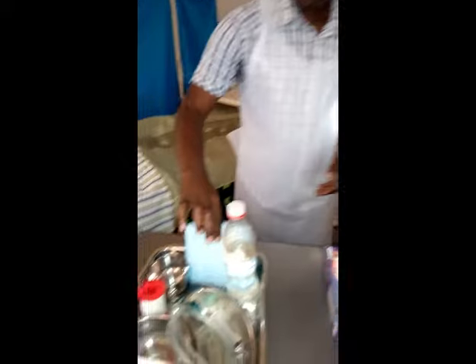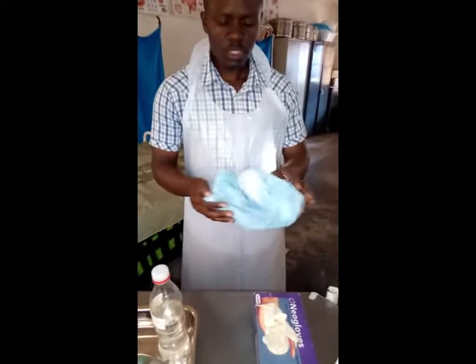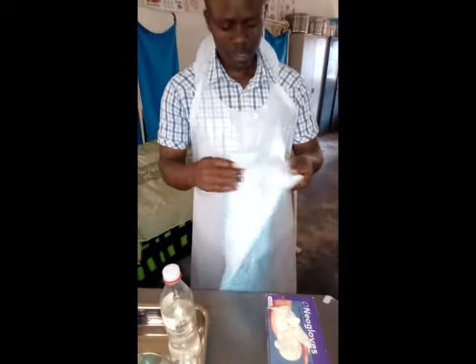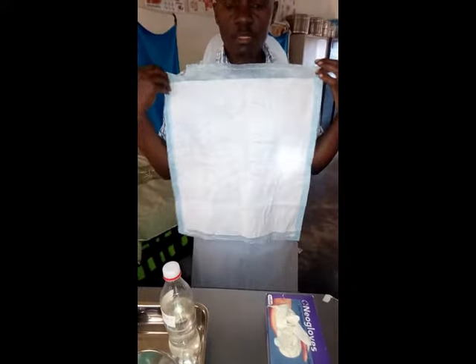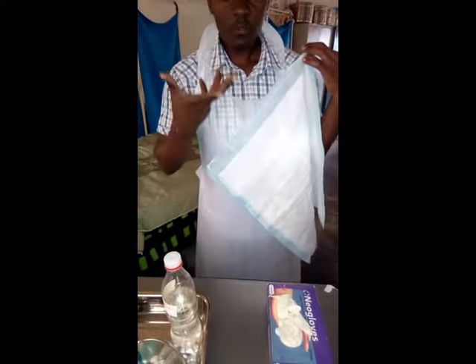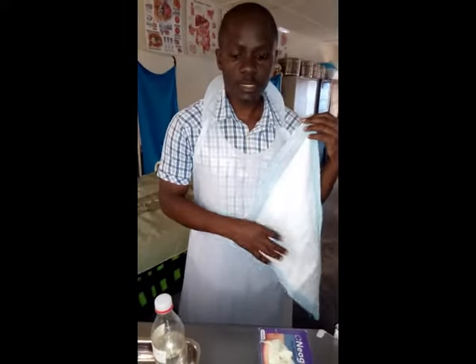Then this is an incontinent sheet. I'm sure you know about an incontinent sheet. We place it as we are inserting the tube, so that in case of any fluids coming out, the clothes or linen is protected.